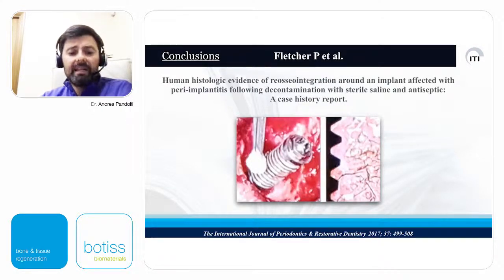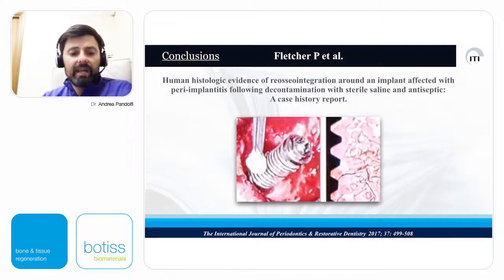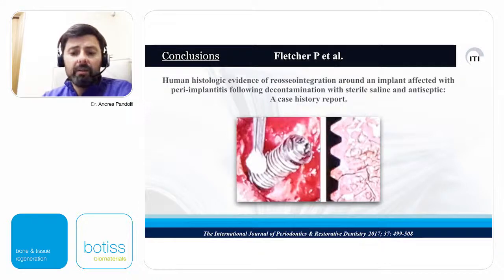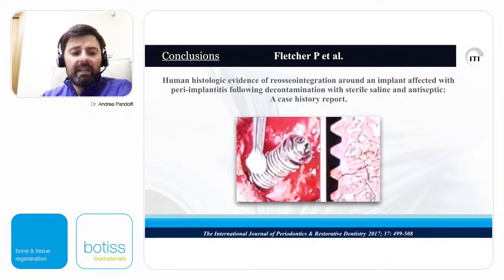After two years I had the opportunity to re-open because the patient had a problem with the distal wisdom tooth. I took a bone sample from the area where I had placed biomaterial to check how it had been replaced. The probe did not enter — there was a new bone level and close contact between bone and implant surface.